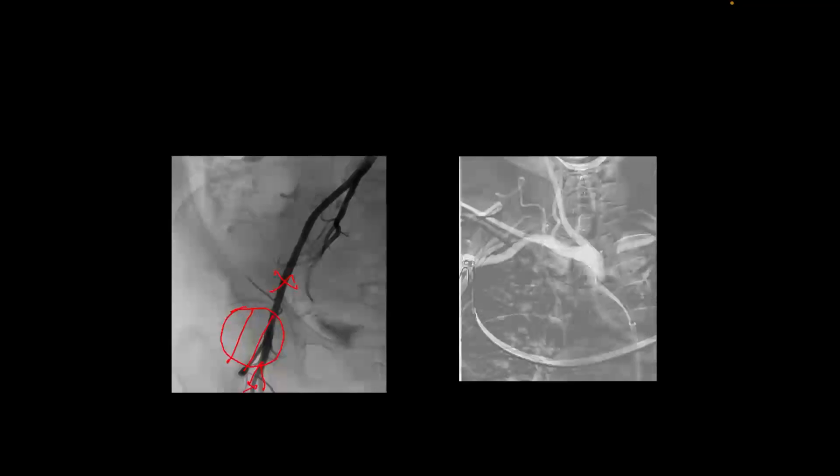If you puncture lower down, what is the problem? You will be entering a branch rather than the main artery. It will be dividing into 2 branches, and you might puncture the artery, but you will be puncturing the branch. So ideal location to puncture is in the main artery, femoral artery. And if you go by this diagram radiologically, you identify the femoral head. So the puncture should be at somewhere in the middle of the femoral head. Clear? Yes. So this is a clean puncture. So the chance of the patient having any complication is much lower in this.